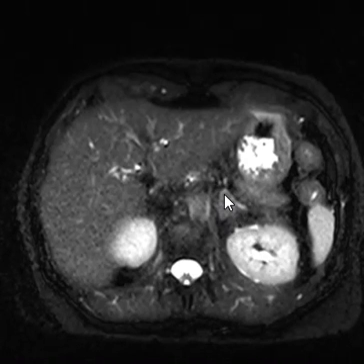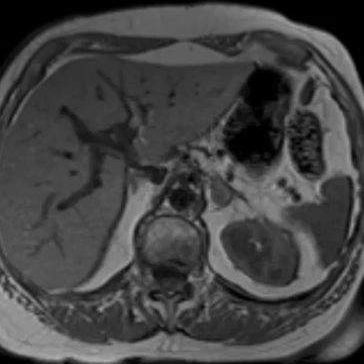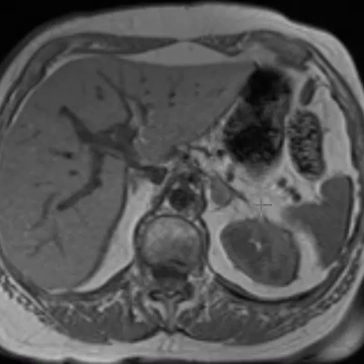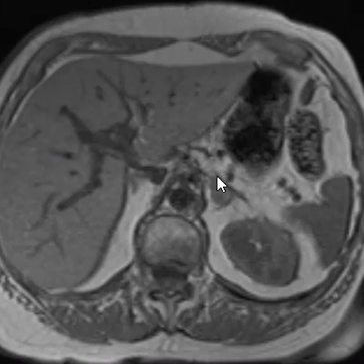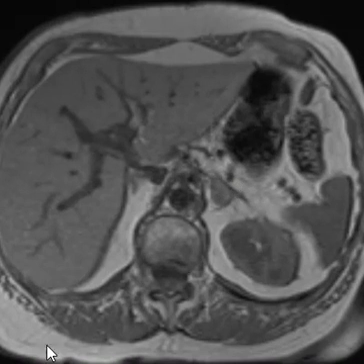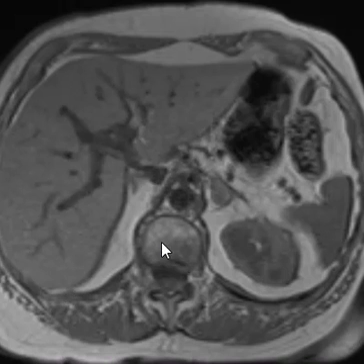Now we're going to put up our in and out of phase images to see if it's an adrenal adenoma. This is an in-phase image. This is the adrenal gland here. It's fairly bright like the liver, and this is where the fat and fluid signal is additive, so it's pretty bright.